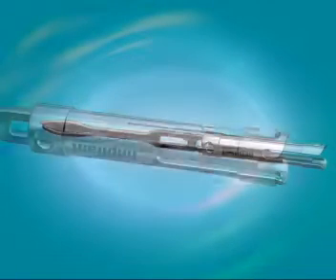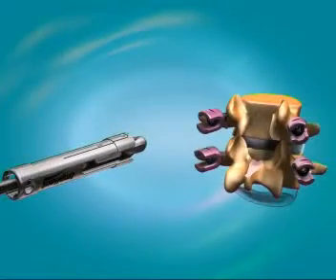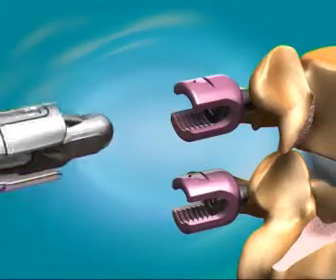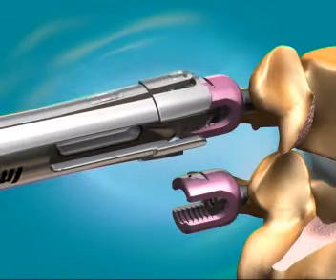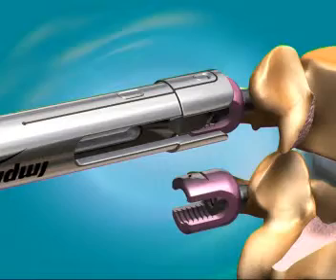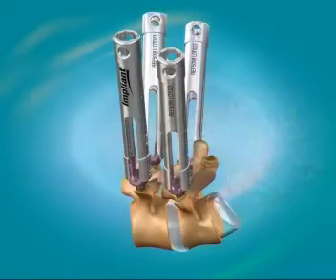Mount the pedicle screw guide onto the screw finder. Locate the pedicle screw head with the finder. Slide the pedicle screw guide down until it can no longer be advanced. Remove the screw finder and verify that the screw guide is locked onto the pedicle screw head. Note that locking occurs only after the removal of the finder.